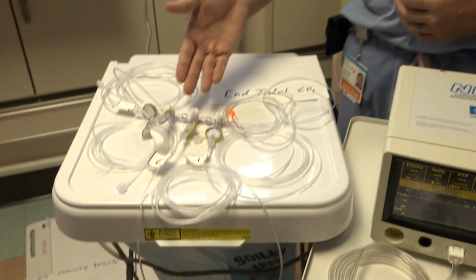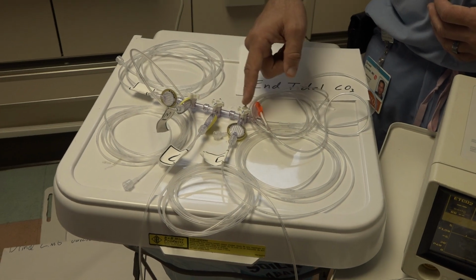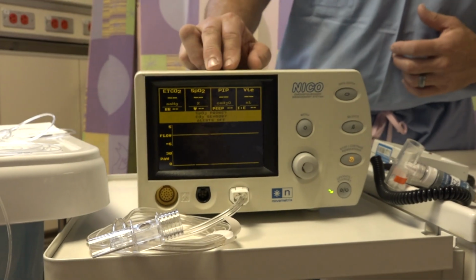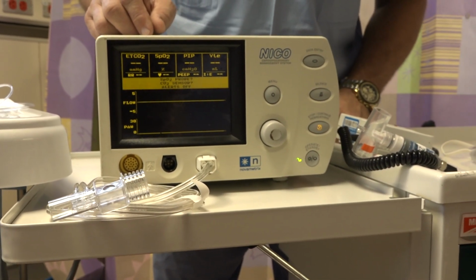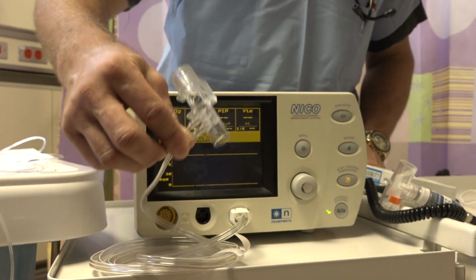So I just want to talk a little bit about monitoring. We talked before about end-tidal CO2 monitoring here and the manifold, which is made up of three-way stopcocks. And then this will go directly to your monitor. Next, we have over here a monitor which can read tidal volumes and peak pressures and also end-tidal CO2 measurements, and this is just an inline connector right here.